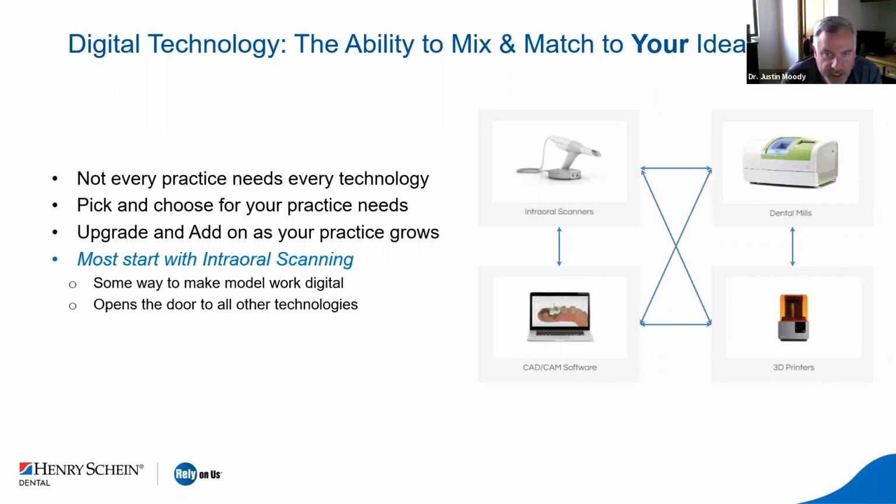Digital technologies are available for us, but the truth of the matter is not every technology is right for every single practice. Many practices kind of pick and choose where they want to jump into digital technology, but the truth is most of it starts with just intraoral scanning.